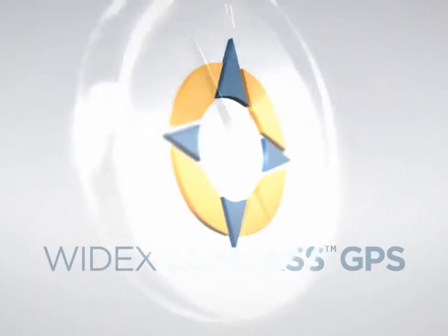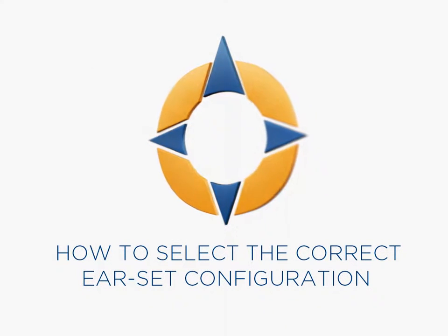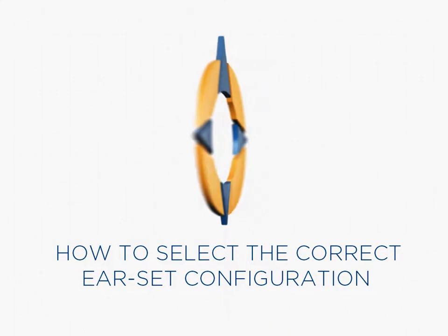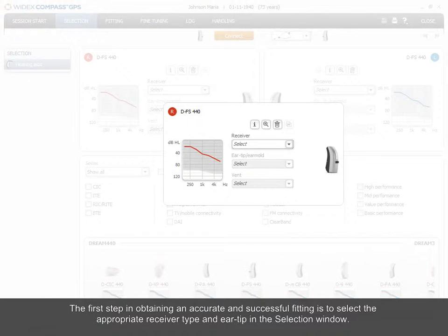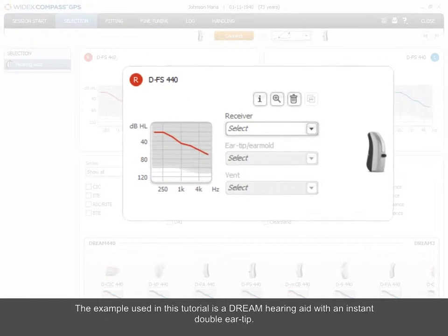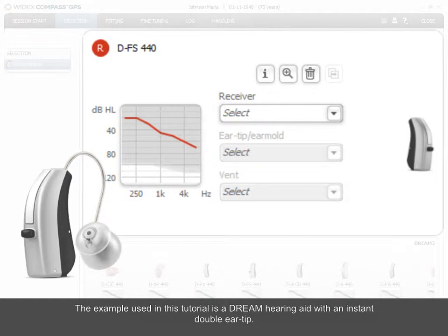Welcome to this Widex eLearning tutorial on selecting the correct earset configuration in Compass GPS. The first step in obtaining an accurate and successful fitting is to select the appropriate receiver type and ear tip in the selection window. The example used in this tutorial is a Dream hearing aid with an instant double ear tip.